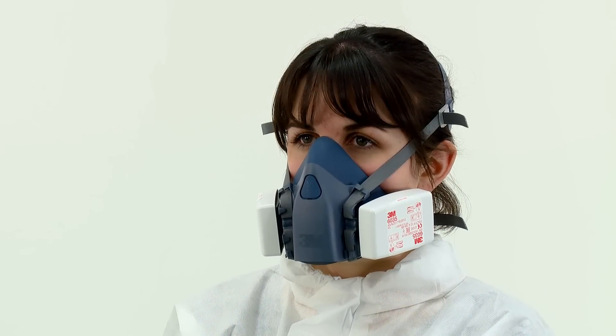The seal of the respirator on the face should be fit checked before entering the workplace. If 6035, 6038, or 2000 series particulate filters have been fitted, a negative pressure fit check should be performed.